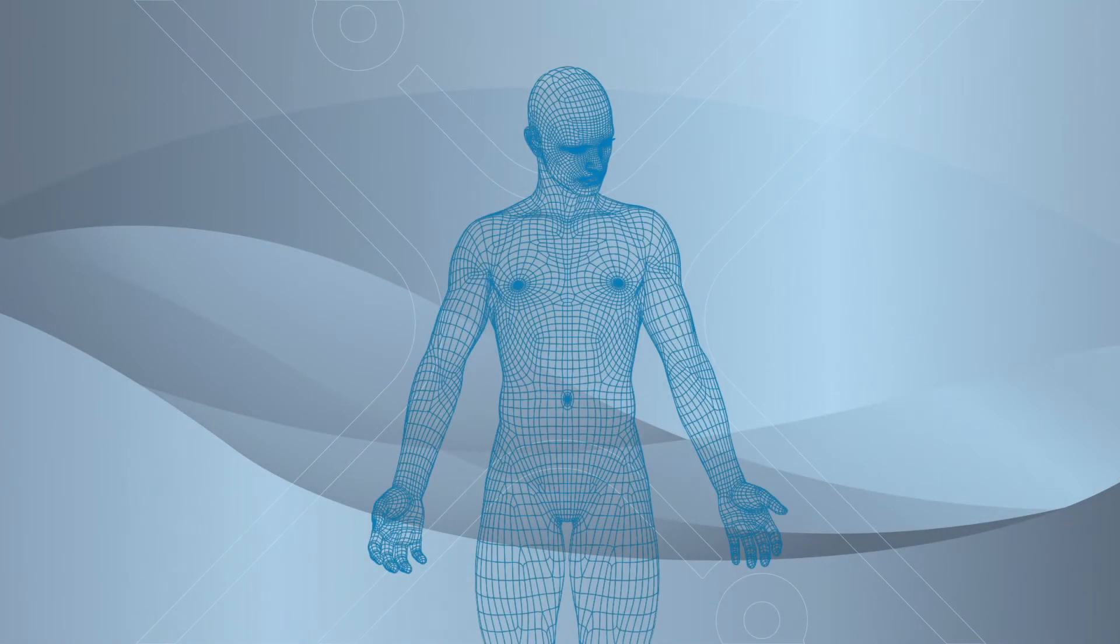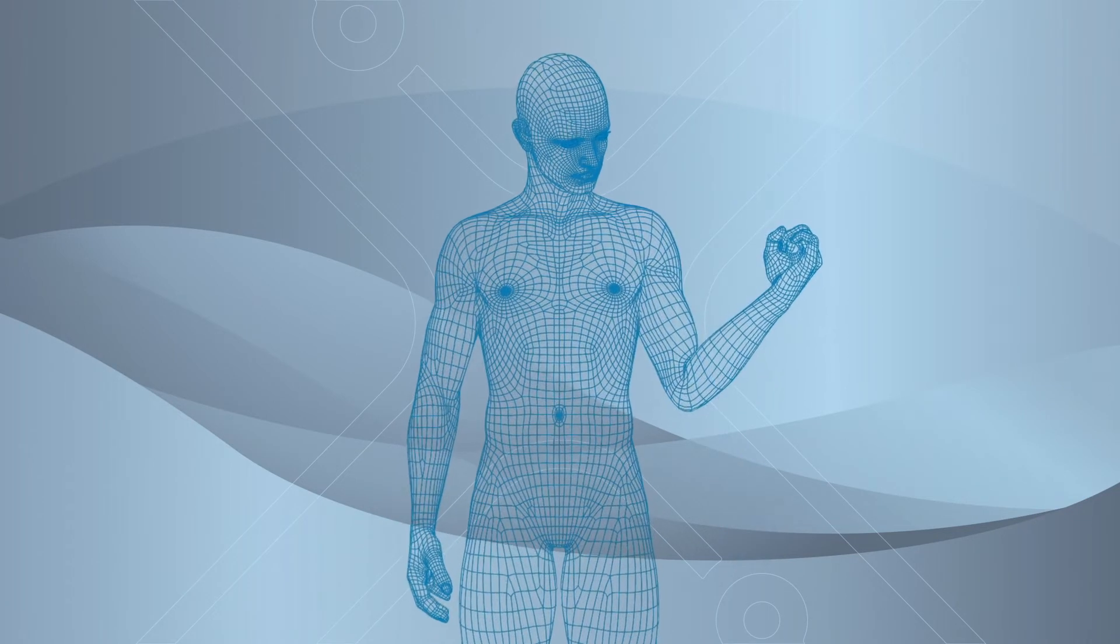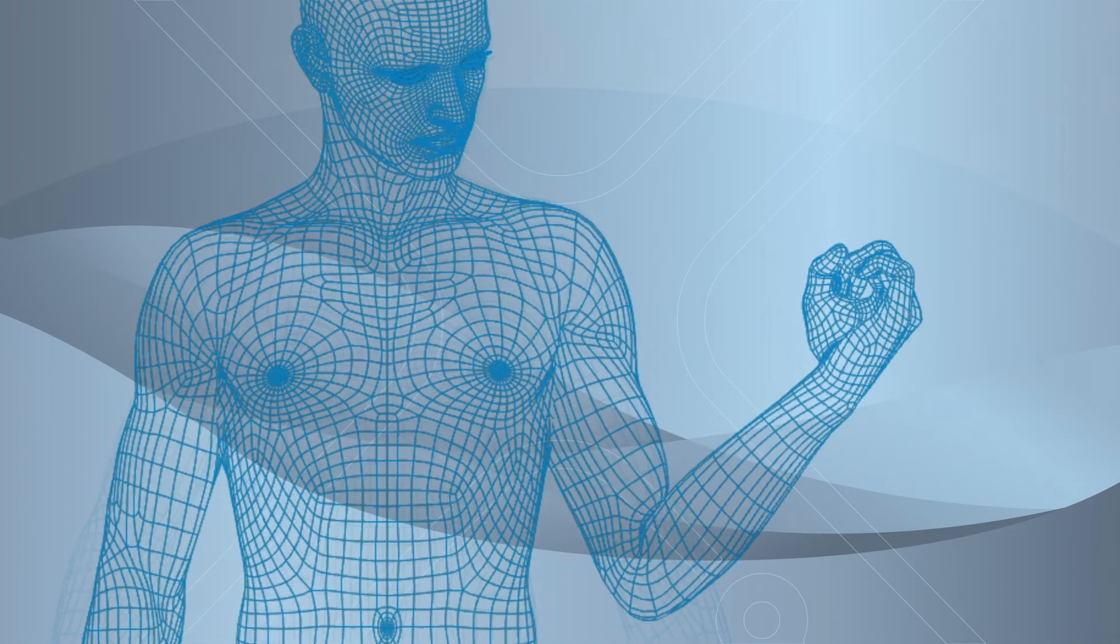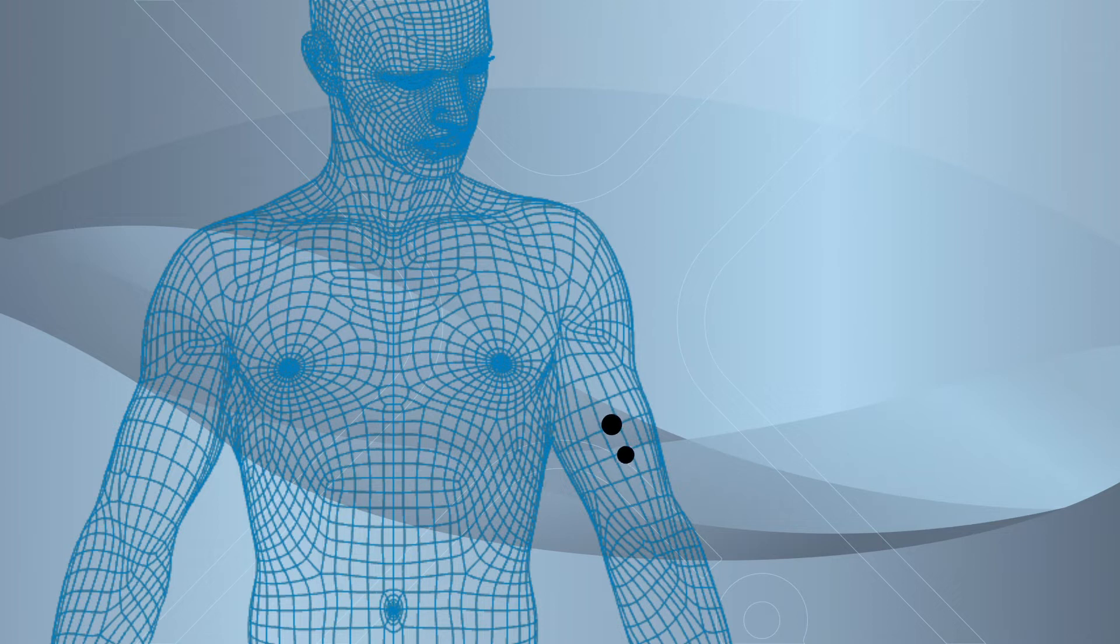First, we choose a muscle of interest from which we want to acquire the EMG signal. Let's take the biceps muscle as an example. We have to consider that the two measuring electrodes are placed centered on the muscle belly, with orientation along the muscle fibers and with 2 cm spacing between the centers.